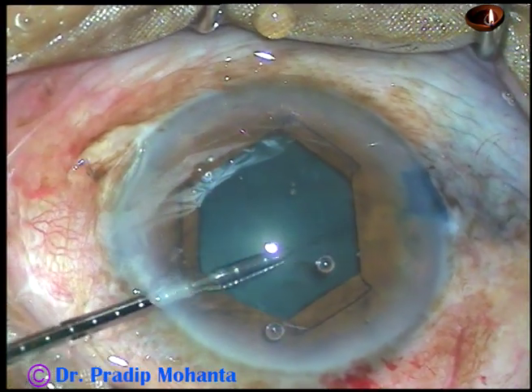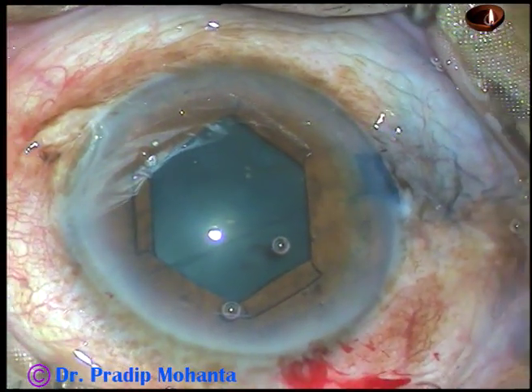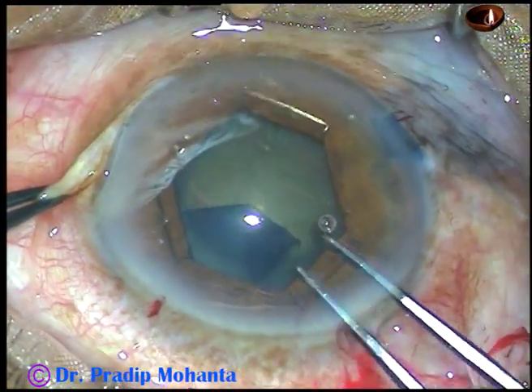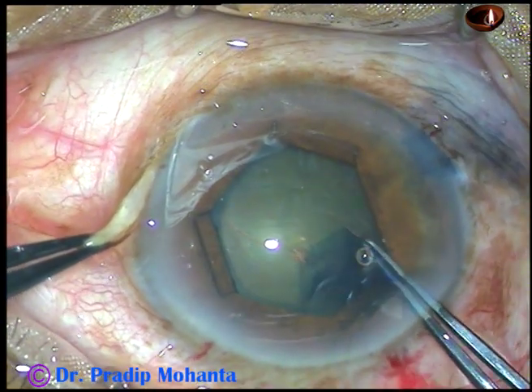With this device, we get a pupil of about 5.5 mm, and the rhexis that we get is about 5 mm in size.